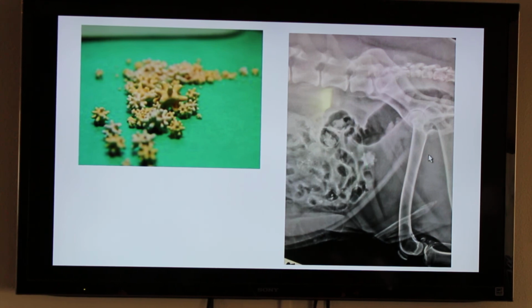Later on we did a cystotomy, which is to cut into the bladder and remove and flush. And we pulled out one of these little guys, and it was beautiful. As far as what causes it, nobody really knows. We think probably diet. So some diet restrictions might be made to keep these from forming again. I can imagine they've got to be pretty painful.